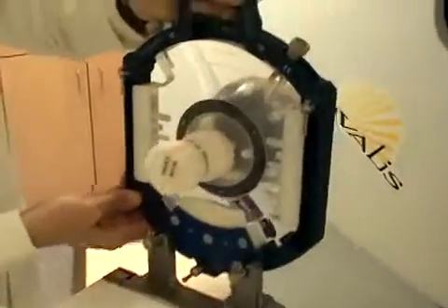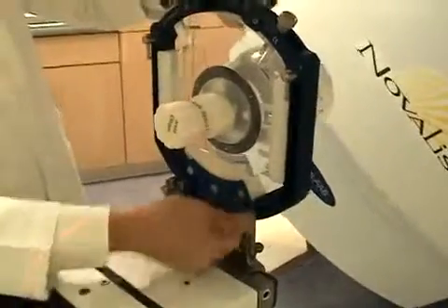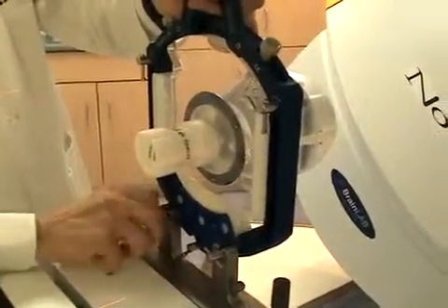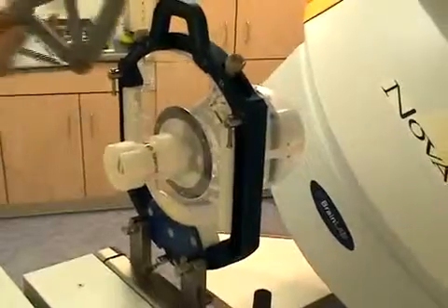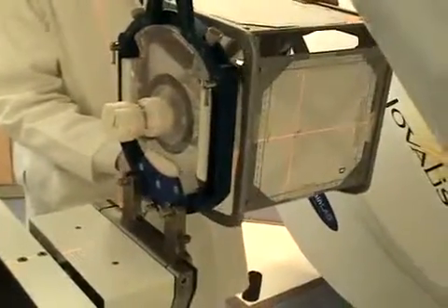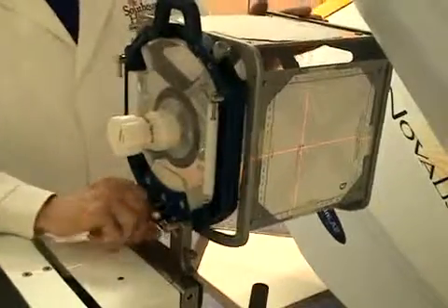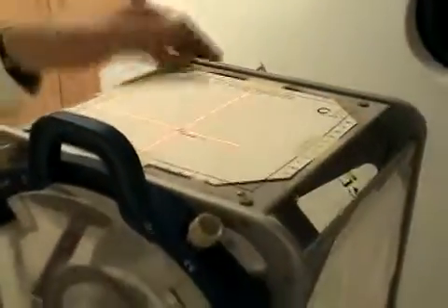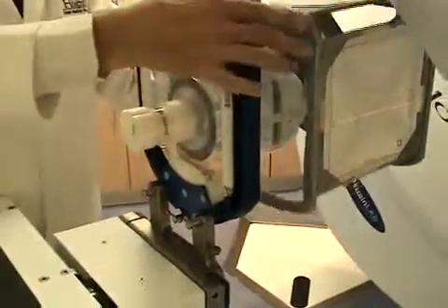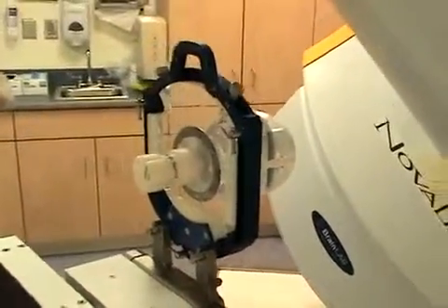Now we want to set this up for treatment. We're going to mount this using the BrainLab head mount. We put on the localization box with the templates produced by the treatment planning system that have isocenter marks that we align to our lasers. Once that is aligned to your satisfaction, we take that off and it's ready to perform the planned treatment.